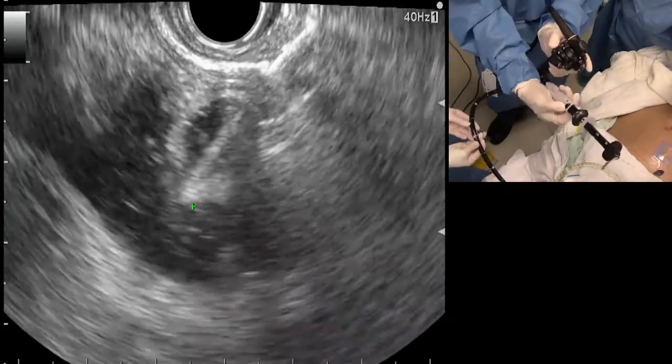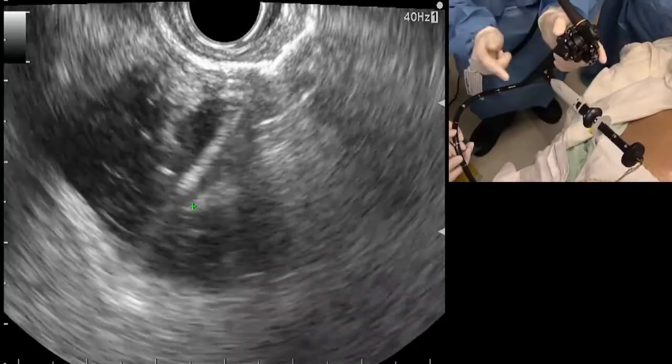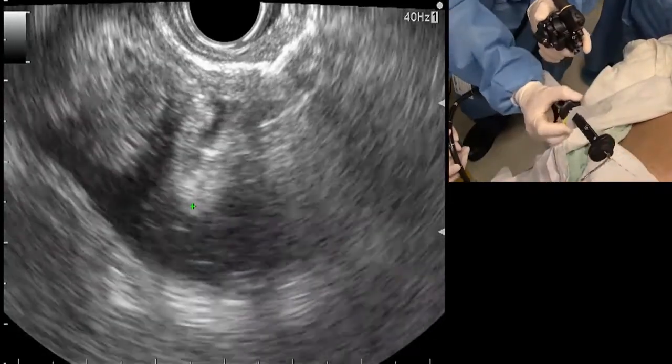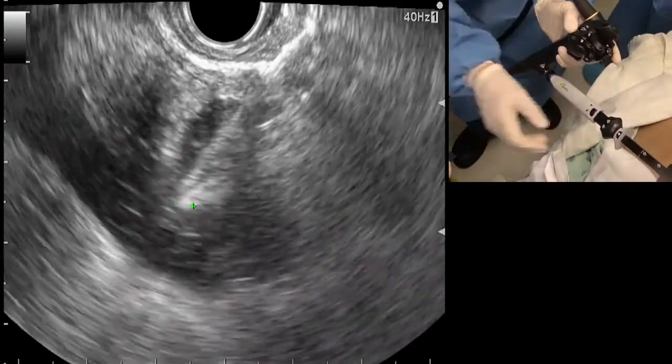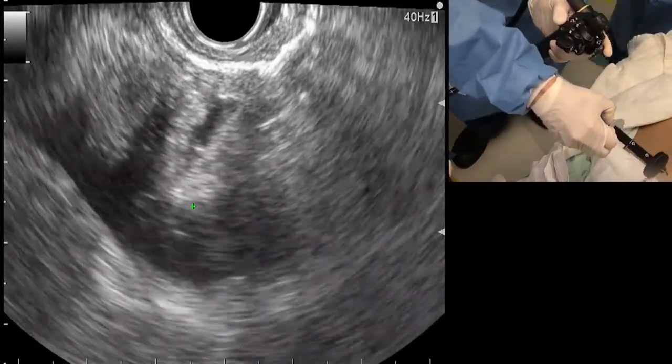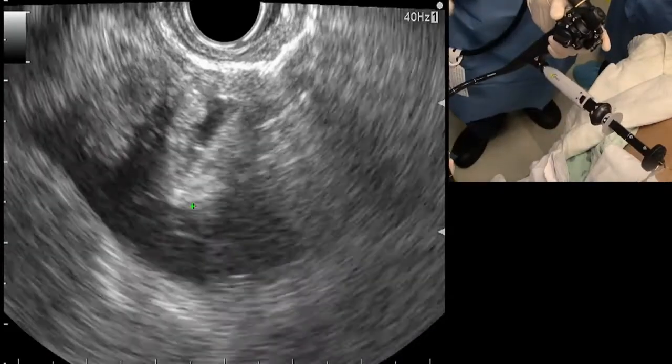So hopefully you can see on the screen. Push it in like this. I'm going to lock like that. I'm going to take off the safety. This is this yellow pin, okay? And I'm just going to hold this like this. And I'm unlocking now the upper hub. This is the gray hub. This is what releases the flanges.